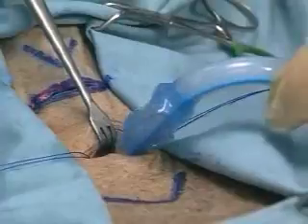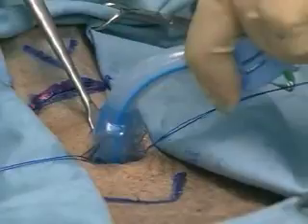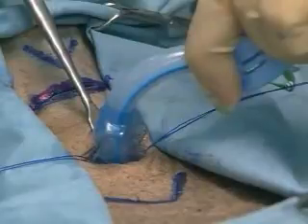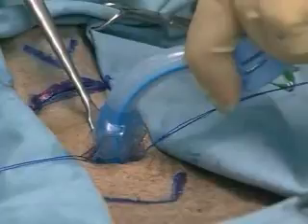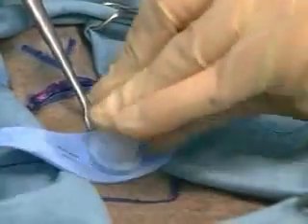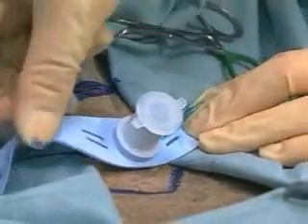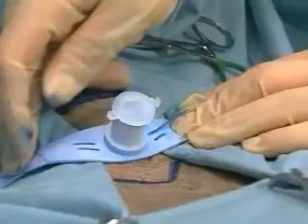The endotracheal tube or tracheostomy tube should initially be inserted perpendicular to the trachea to avoid placement of the tube in the pretracheal space. A number 6 endotracheal tube can be used in emergent situations for either cricothyroidotomy or tracheostomy. The endotracheal tube is inserted to a depth of 8 to 10 centimeters. Care needs to be taken not to insert the endotracheal tube too far, or unilateral bronchial intubation may occur.